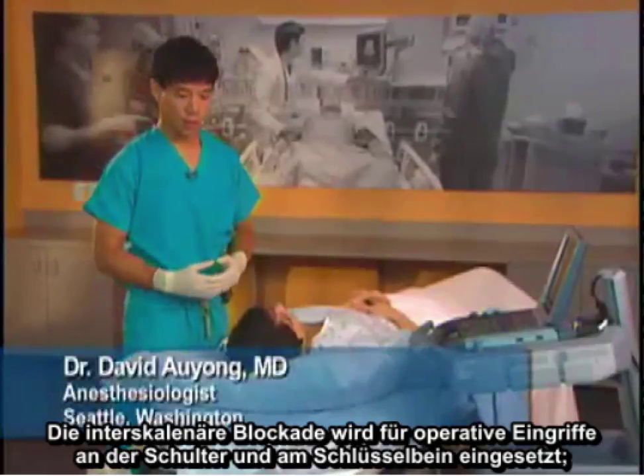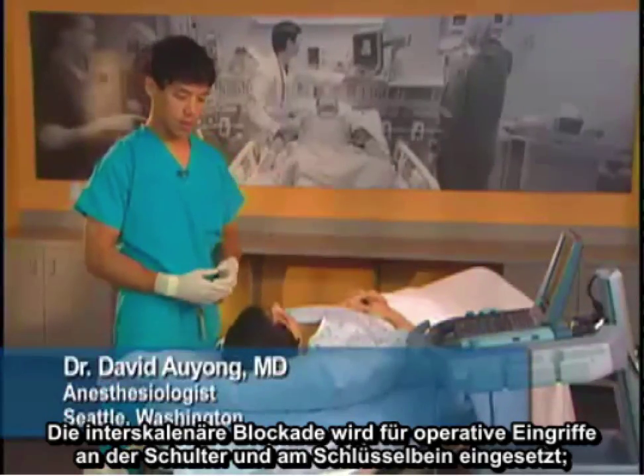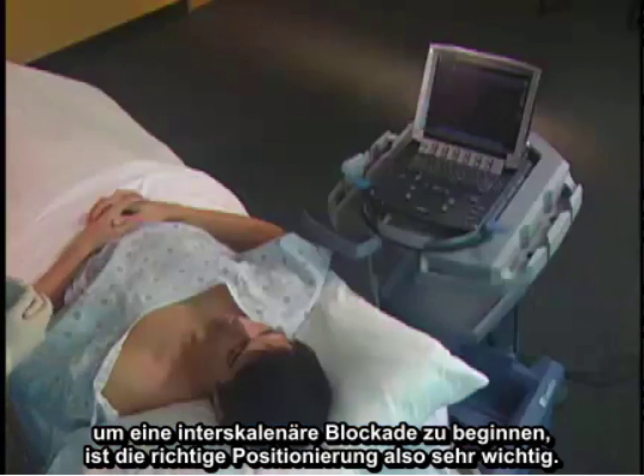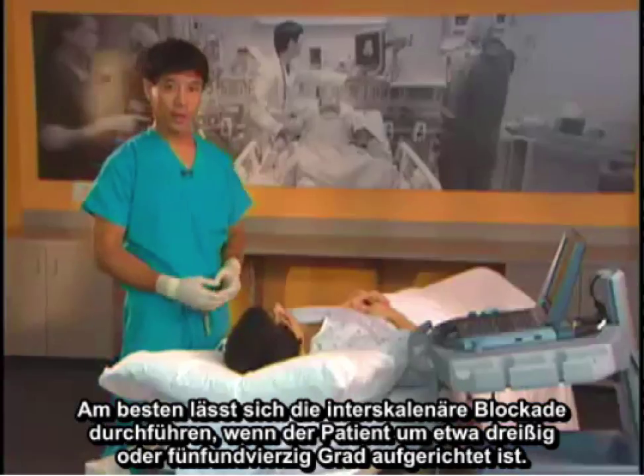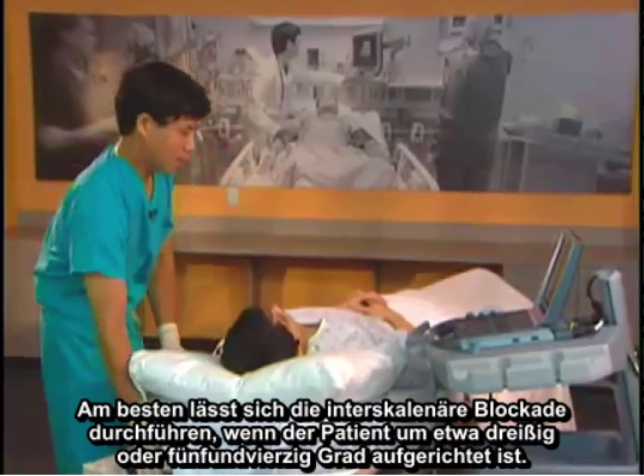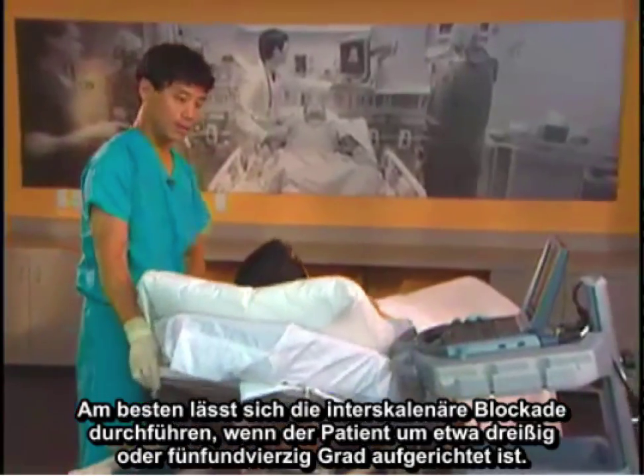The interscalene block is used for shoulder surgery and clavicle surgery. To start the interscalene block, proper positioning is very important. The best way to perform the interscalene block is to have the patient sitting up about 30 to 45 degrees.